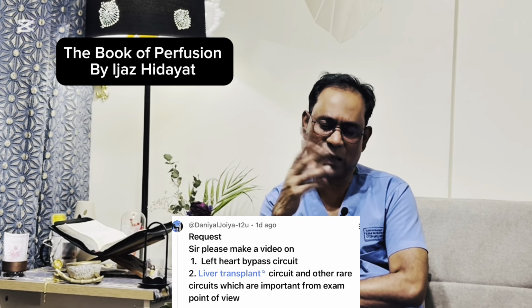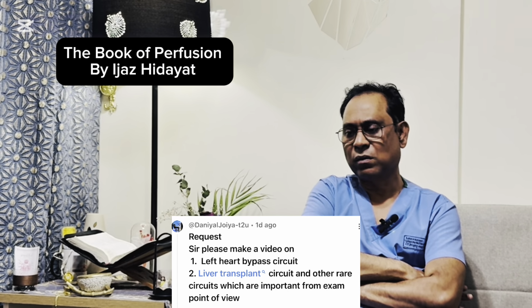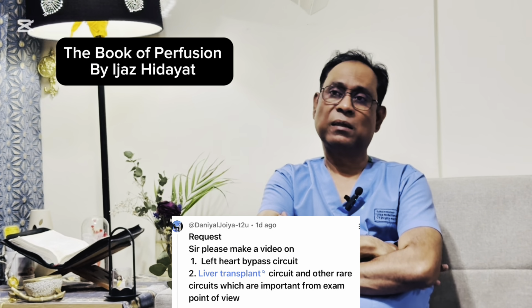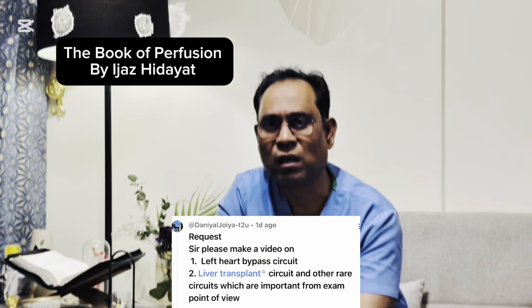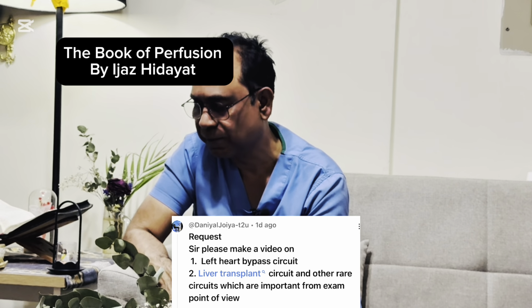The cardiac output through the left heart bypass is not a full flow, but around 50% flow, because the native heart is still ejecting and still working. So we do left heart bypass by keeping the heart in the ejection phase, so we don't lose the pulsatility of the arterial line. We keep around 2 to 2.4 liter flow during the left heart bypass.